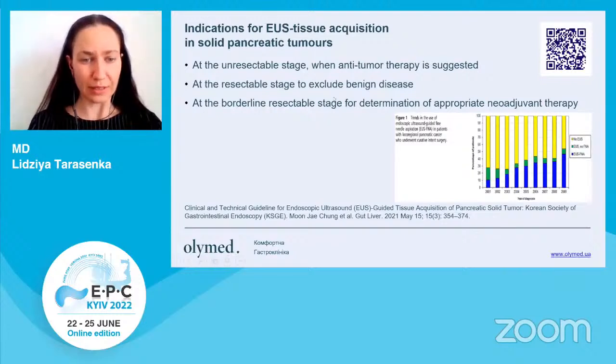Current, for example, Korean guidelines contain clear indications whether we need to biopsy a pancreatic lesion or not. Usually, guidelines are not so clear. The majority of them state that you need to biopsy a pancreatic lesion if clinically indicated. But the fact is that the majority of cases suspicious for pancreatic cancer nowadays demand verification, though it really depends on local practice and guidelines.